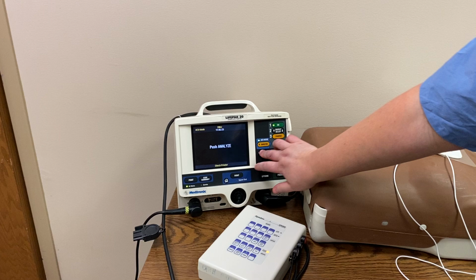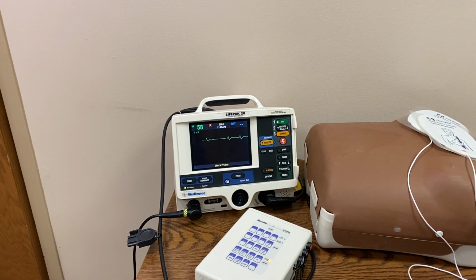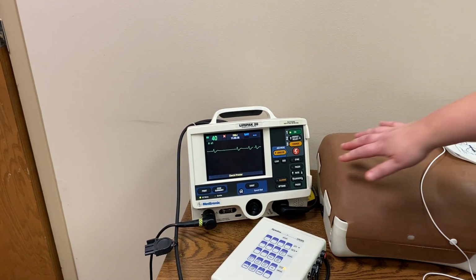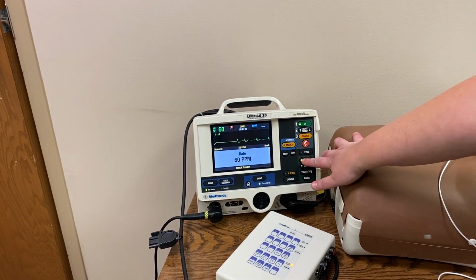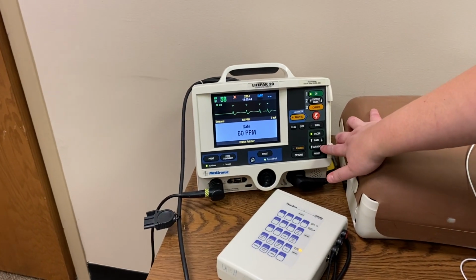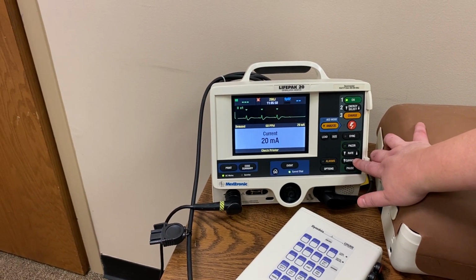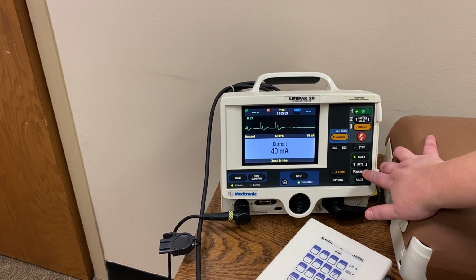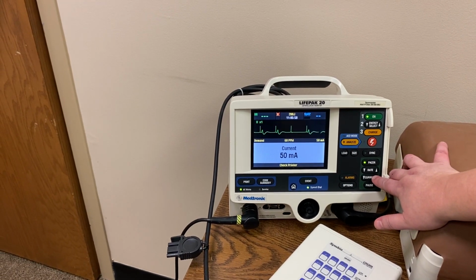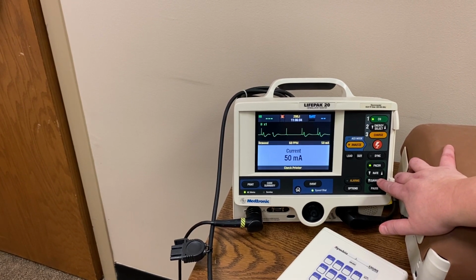Push analyze. And as you can see, our patient is in a second degree type 2 rhythm. So what we would first need to do is turn on the pacer. It automatically defaults to a rate of 60, and we're going to take the current and start turning it up. It starts at 0 and goes by 10, 20, 30. If your patient is very thin, 50 is probably a good current, but if you have a heavier patient, you are going to need to go up pretty high on your current to make sure that you get capture.